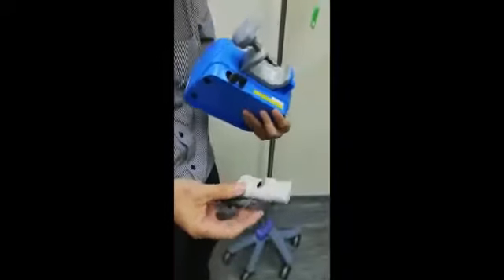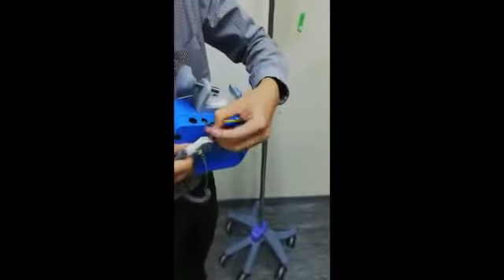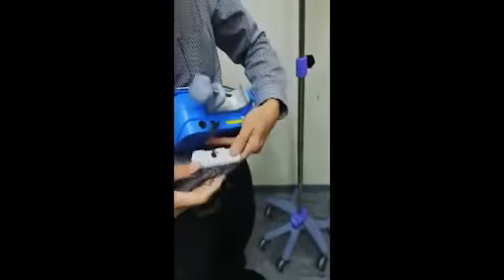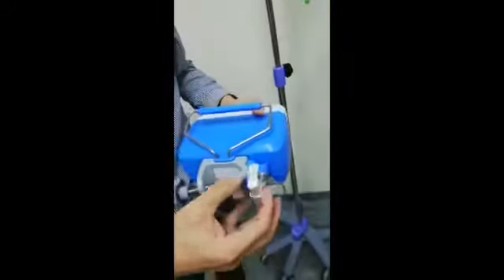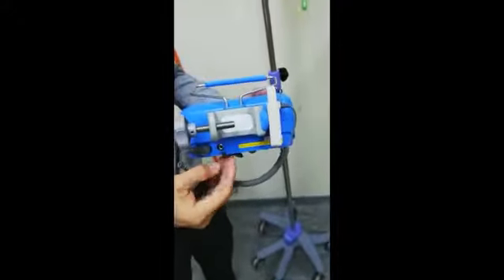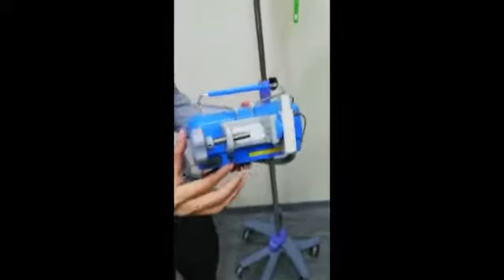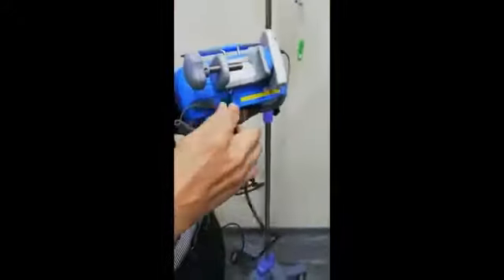I'll show you how to fix the drop sensor on the pump. At the back of this pump, you can see there's a connector point here. Just take out the drop sensor and connect it over here. Then this is how you locate your drop sensor over here at the left-hand side. Okay, this is the point for the AC adapter. Connect the AC adapter like this.